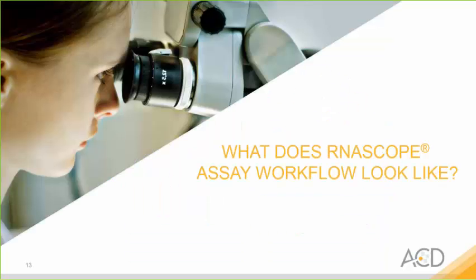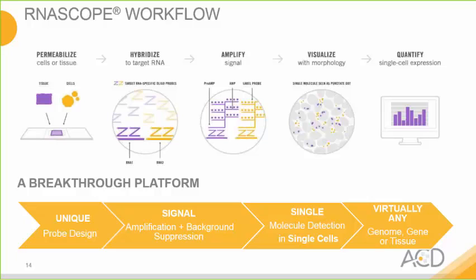Okay, so going back to the RNA assay workflow, what does it look like? Going back to this slide, again, this is on a very high level very similar to IHC. The RNAscope assay starts with permeabilized, properly prepared, and fixed tissue with RNAscope pretreatment reagent to allow the target probe to penetrate into the cell, bind to the target sequence, and the specific sequence is recognized by the double Z pair, then gets amplified through the amplification cascade.